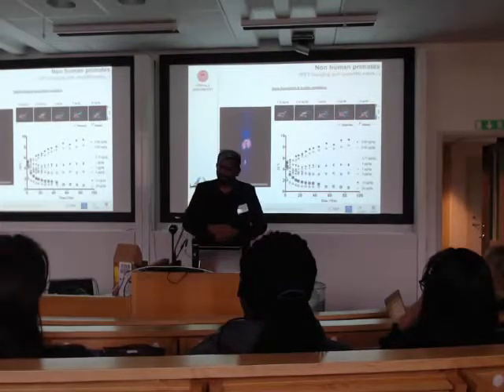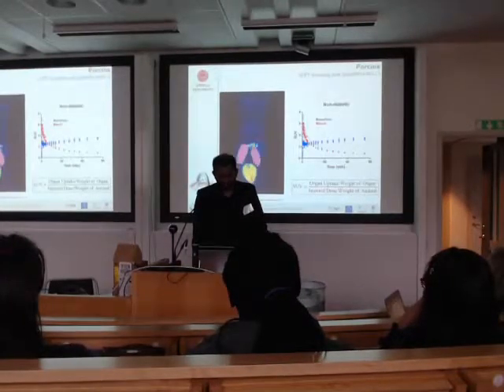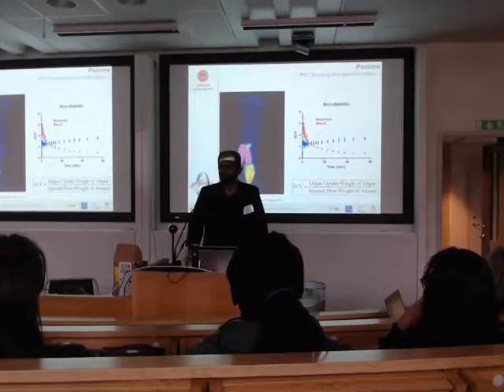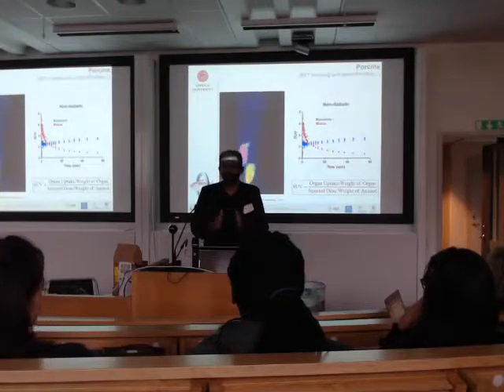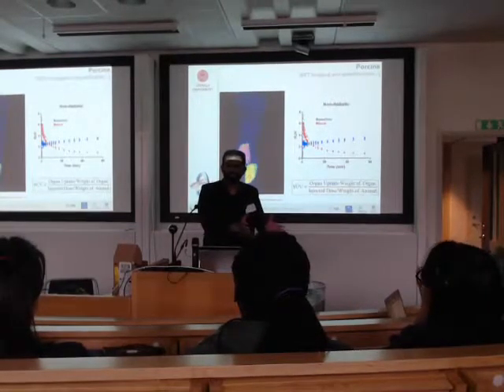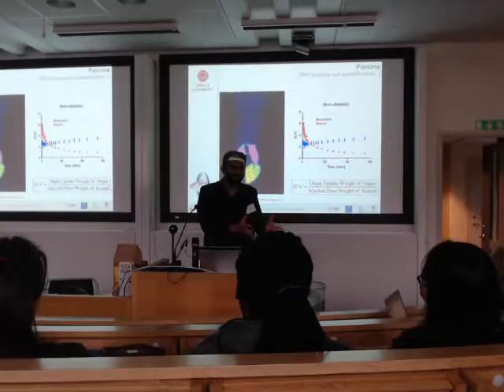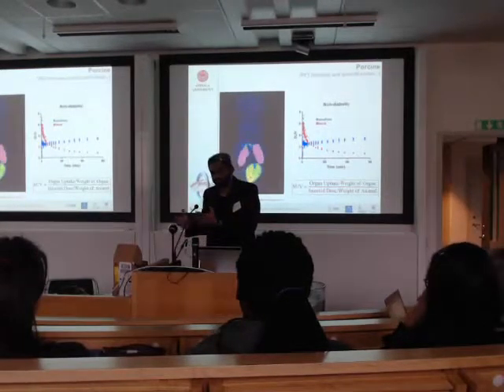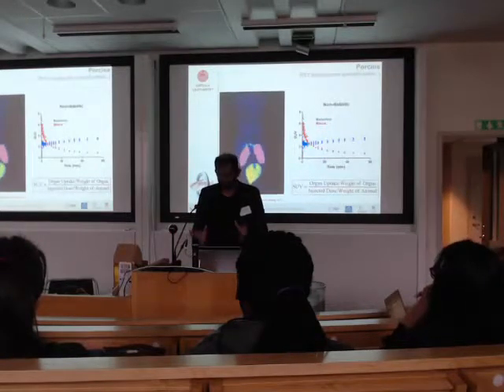So the team still had more money. They did studies on pigs. It was relatively easy to get an ethical permit to make the pig diabetic. Long story short, non-diabetic pigs have islets in the pancreas, so technically you should see uptake in the pancreas. Diabetic animals don't have any islets, so you shouldn't see any uptake in the pancreas. Easy study design. Cool. So we started with the non-diabetic animal model.